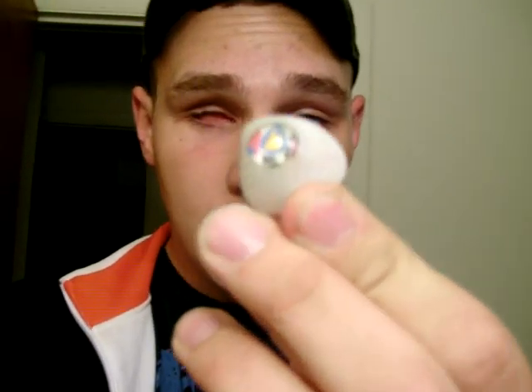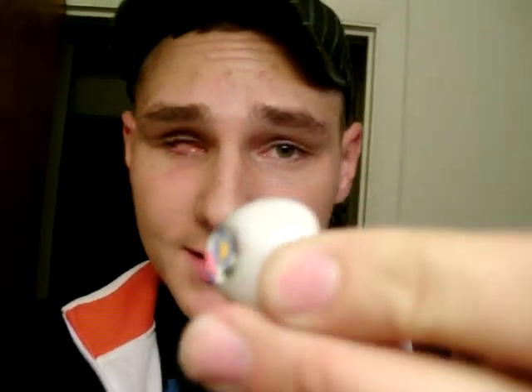First of all, we're going to start the procedure with extraction. Take your index pointer, take a finger, pull down the eyelid, and then with a slight underneath pressure, remove the prosthetic. Now, here it is. Not like in the old days, or in third world countries, it is not a circular marble-type object.